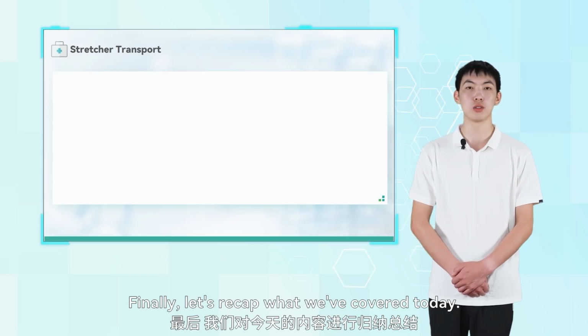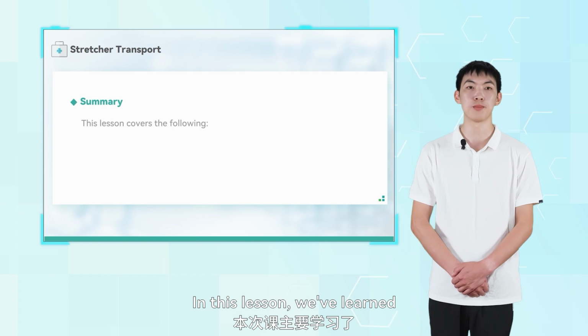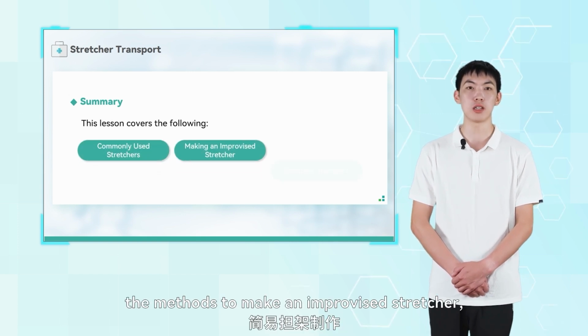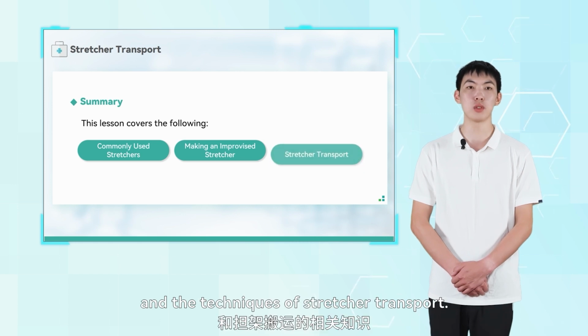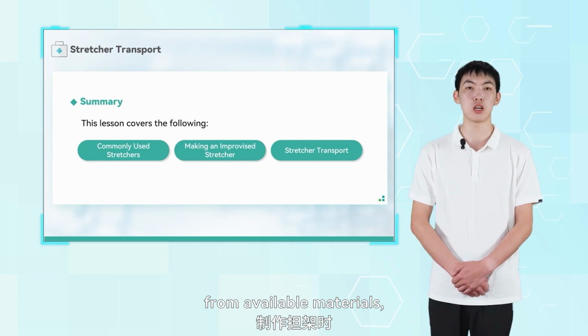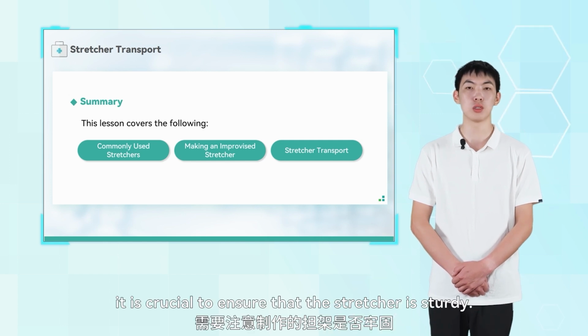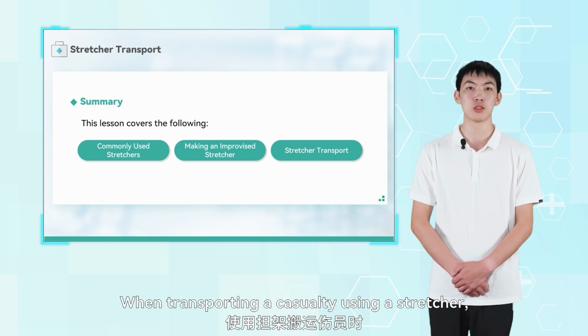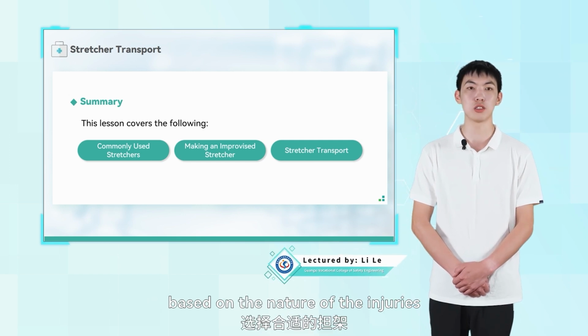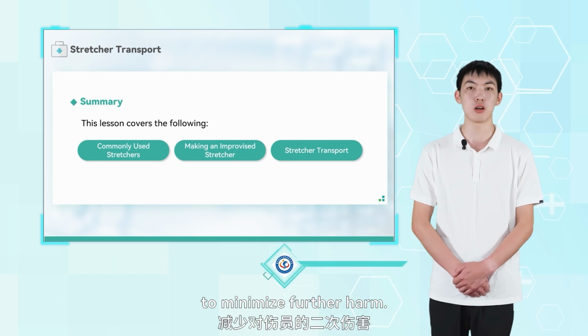Finally, let's recap what we've covered today. In this lesson, we've learned about the types of commonly used stretchers, the methods to make an improvised stretcher, and the techniques of stretcher transport. When making an improvised stretcher from available materials, it is crucial to ensure that the stretcher is sturdy. When transporting a casualty using a stretcher, choose the appropriate type of stretcher based on the nature of the injuries to minimize further harm.